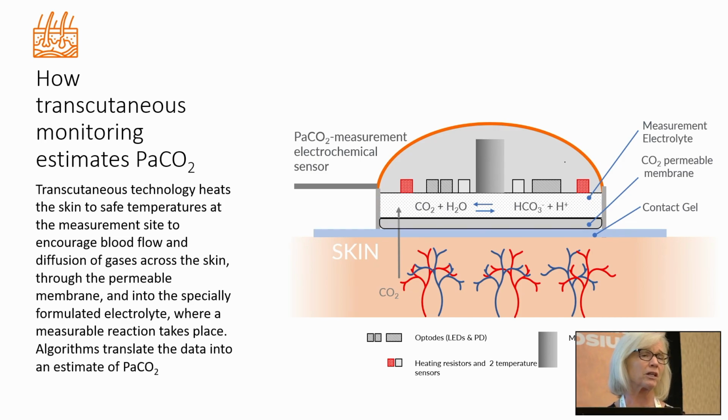Their torso is a really great place as well, but the thing to consider is that any pressure on that sensor matters. If you push on your nail bed, it turns white because you're pushing capillary flow away from your nail bed. So if you're pushing on the sensor, you're pushing blood flow away from your sample site, and that's going to make it inaccurate. So if you use this technology and you find that experience, that's something to consider.